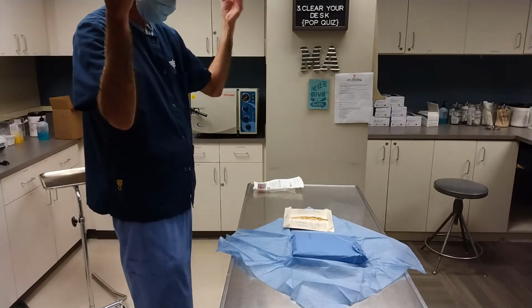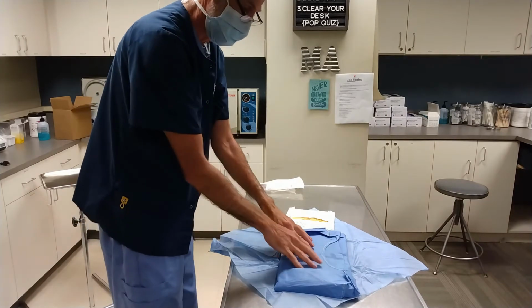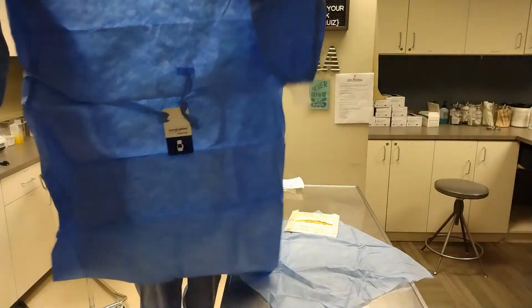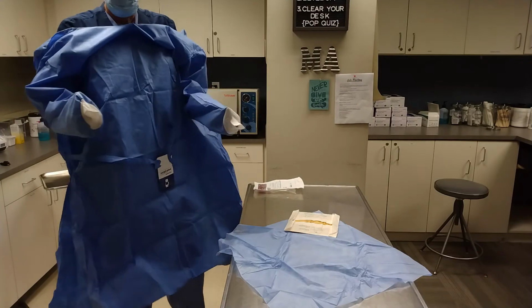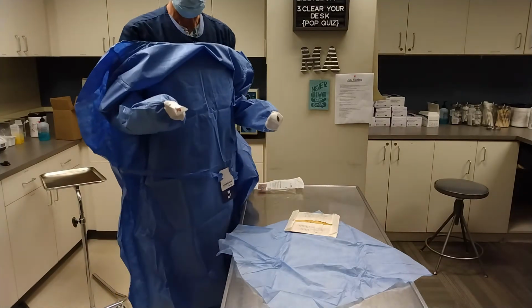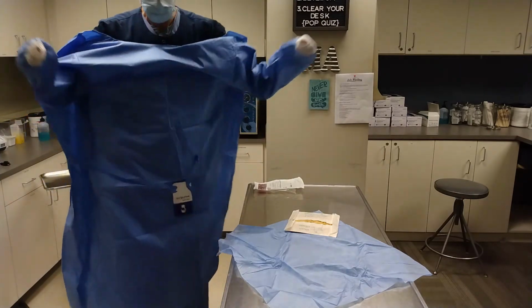Okay, so I'm going to don my gown and gloves. What I just want to do is, it should be laid out like this. So this is the inside of the gown right here. So you can touch here, lift, just like that, right? I'm going to keep my hands inside my cuffs. I'm not bringing my hands out because I'm going to put my gloves on a special way, using it with my hands inside my cuffs. And so in surgery, you usually have a helper. You'll have someone to grab that tag and spin.